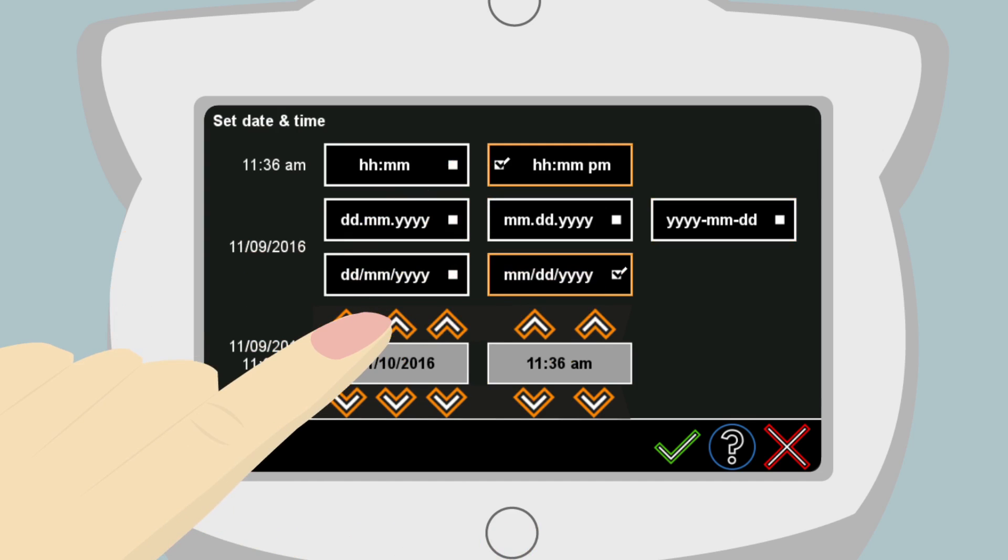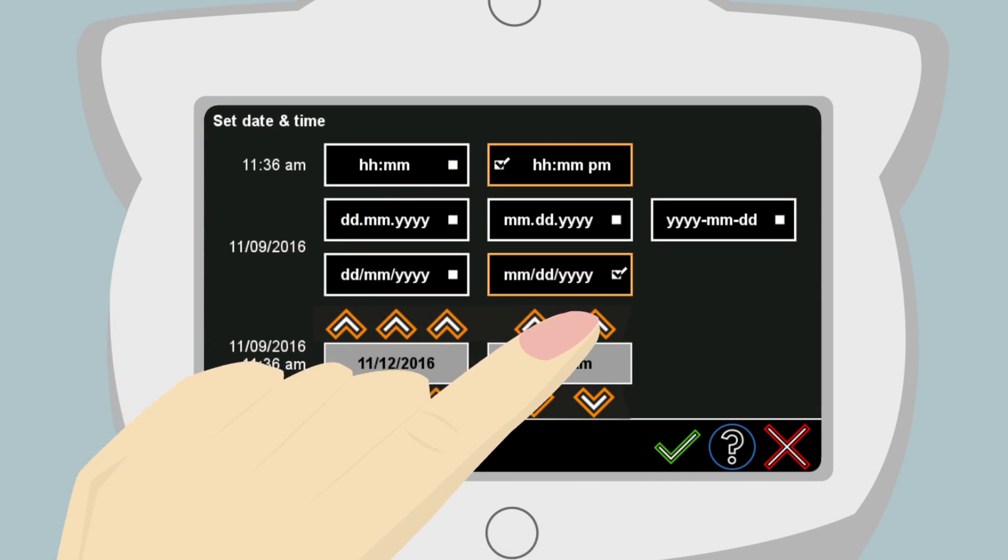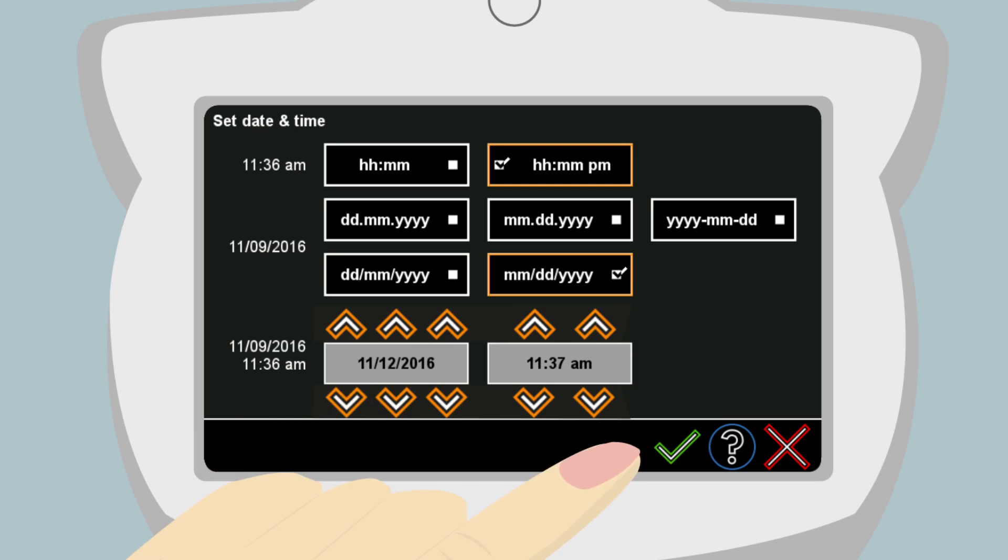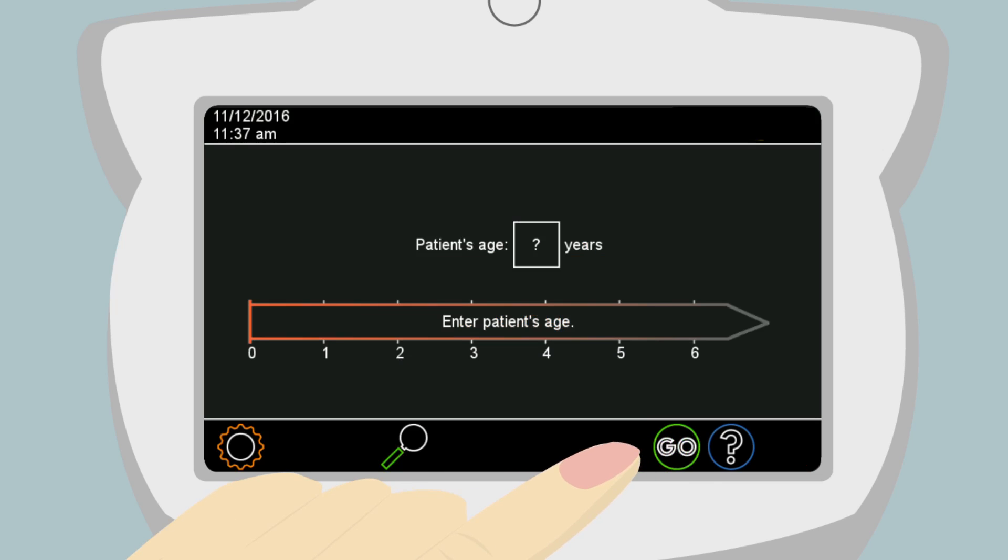Anna uses the up and down arrows to select today's date and time. When the date and time have been properly entered, she touches the green checkmark in the lower right-hand corner. The green checkmark tells the PlusOptics device to save the changes Anna has made. The date and time will need to be set the first time the device is turned on.